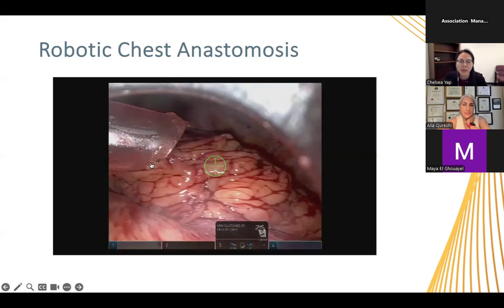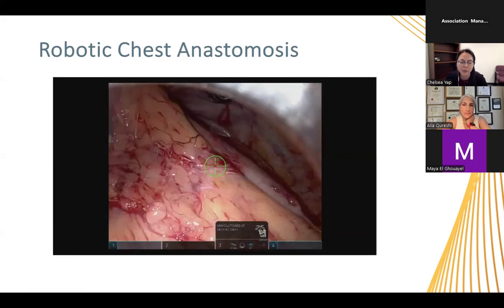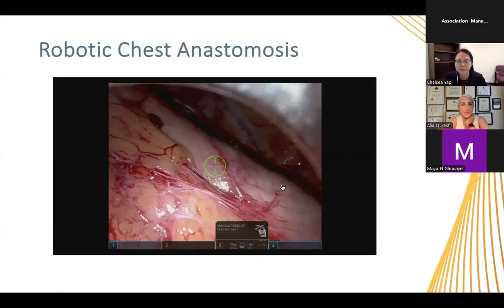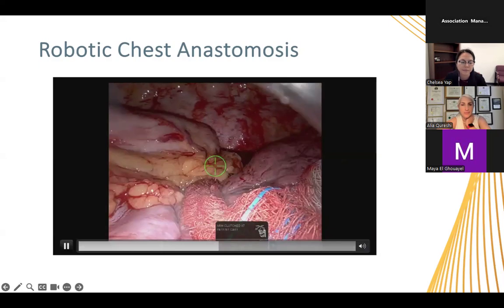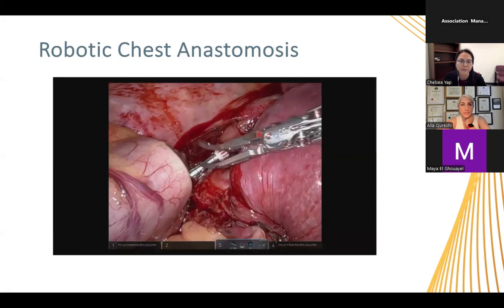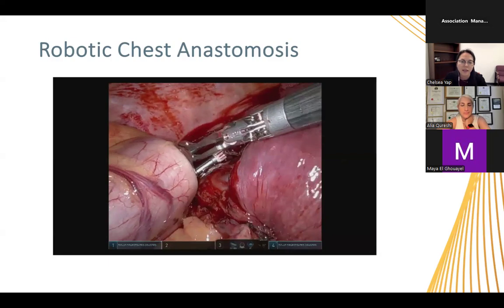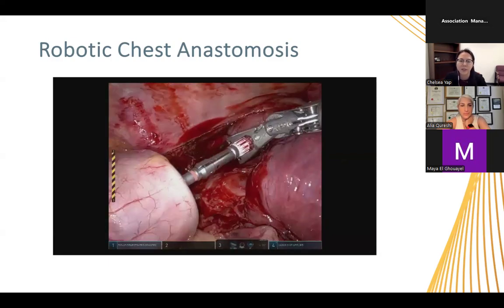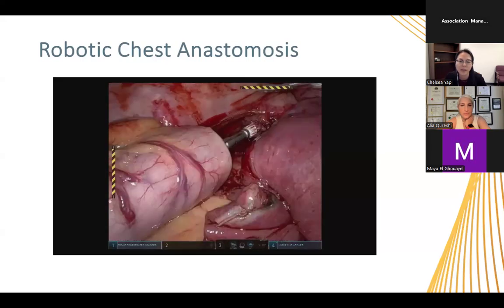Deliver the specimen, make a larger incision in where arm 2 was. And then once we've done that, we take out the specimen and then reintroduce the EEA stapler. We use the 25 EEA through the gastrotomy here. The anvil and the stapler are mated here. And then once we've made the anastomosis, we evaluate our donuts to make sure that we have 2 complete donuts here for the esophagectomy, the gastric donut, and the esophageal donut.